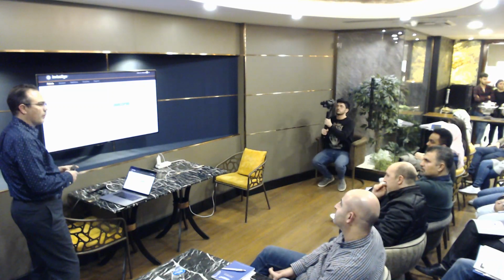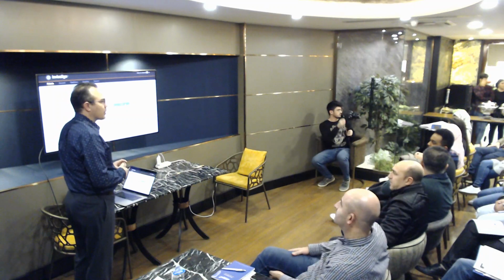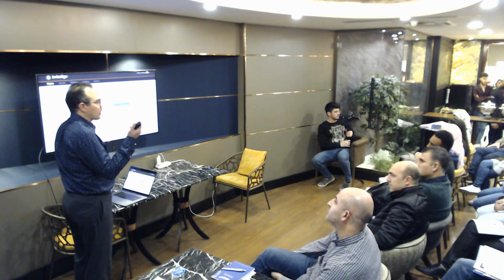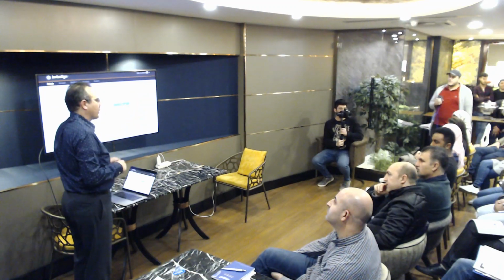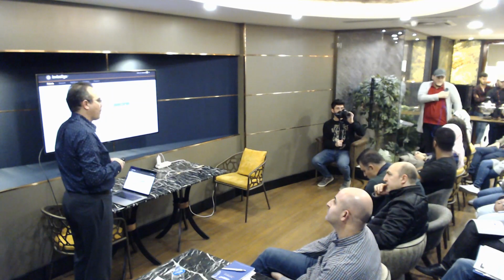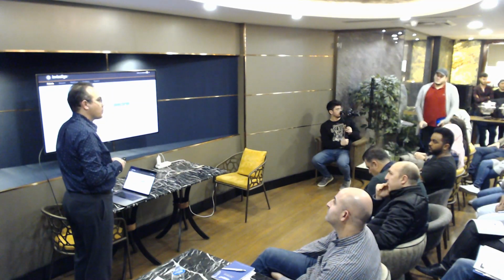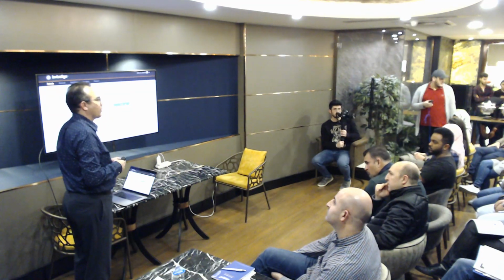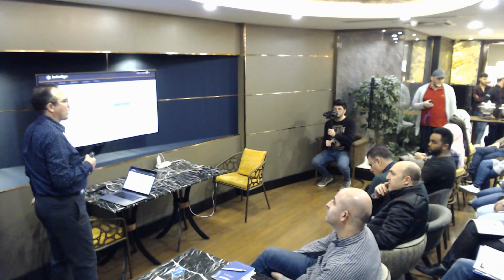Okay, so they connect the scan to the application? Yes, by the patient name, usually the patient last name. So make sure you use the same last name you used on the scanner. And when can I apply the submission after the scanning? How long will it take? If you are using an iTero, after 5 minutes. And if I'm using a normal Invisalign? Usually with Sirona, it might take up to an hour.